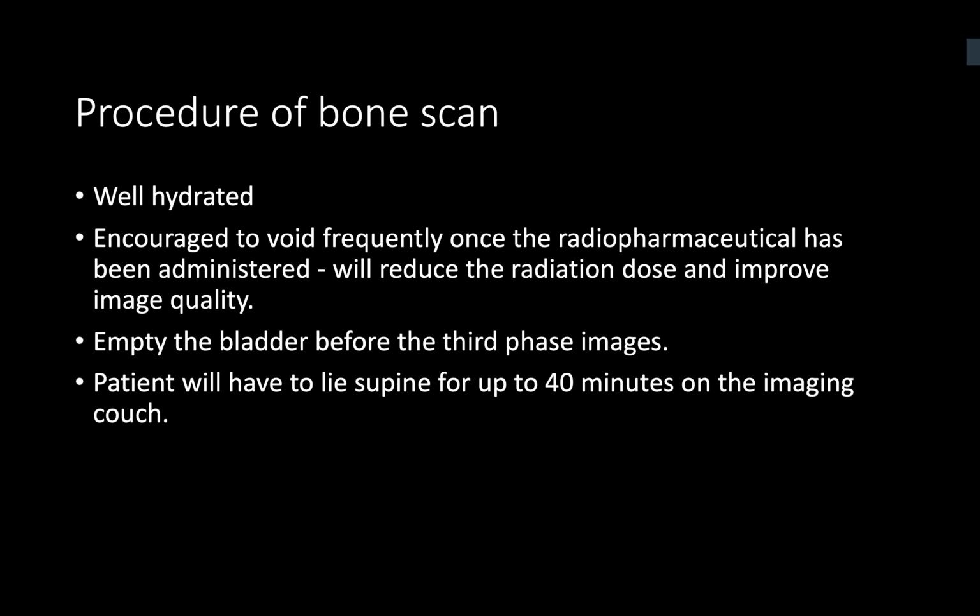Yeah, one thing is right. It has to be well hydrated, and one thing most possibly, because there are some patients with bone positivity and really in pain, so we have to make them well aware that they have to lie supine in a couch for almost 40 minutes. So sometimes they will need to take more painkillers before the procedure. And there are mainly 3 phases of bone scan, of which the third phase is most important. So they may have to empty the bladder before the third phase to get a good imaging of the pelvic area.